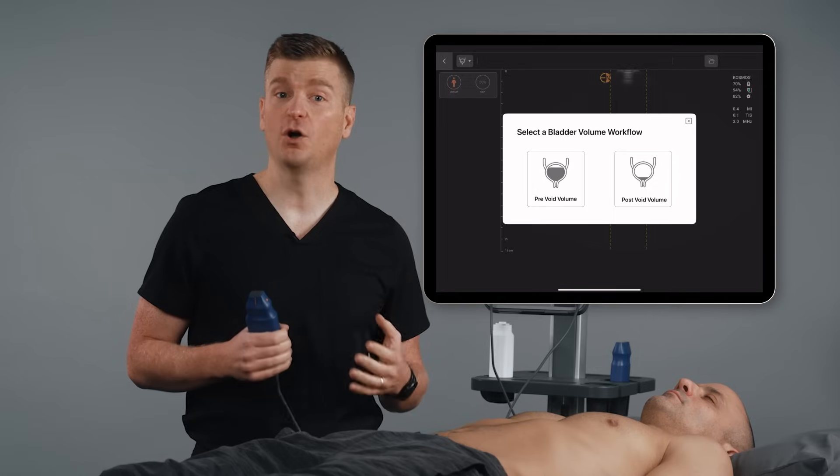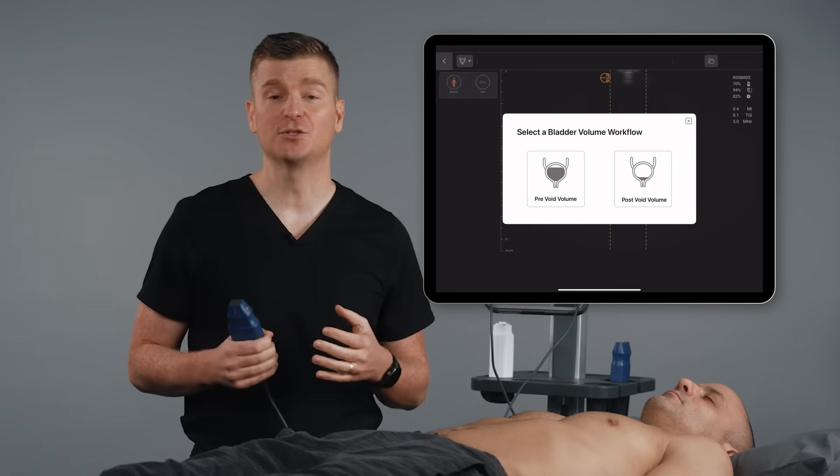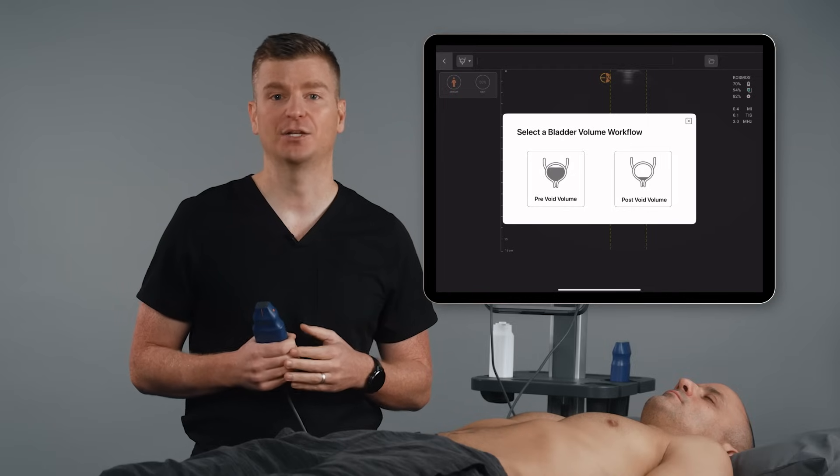On Cosmos Bladder, we have a low volume workflow and a high volume workflow. We did this because it allowed us to adjust the sensitivity of the scanner, as well as making bladder volume calculation not as dependent on your scanning technique. If you're not sure which option to select, use your best judgment, and the AI will direct you to the correct workflow once you start scanning if needed.